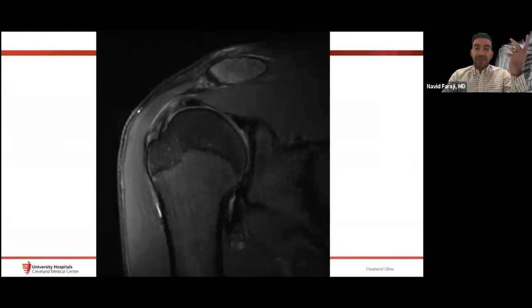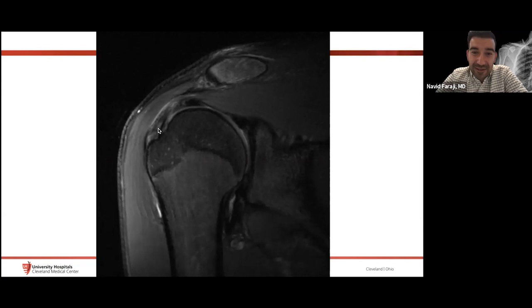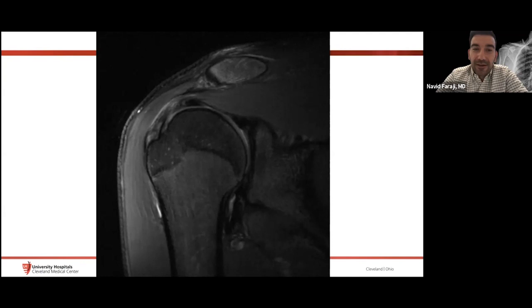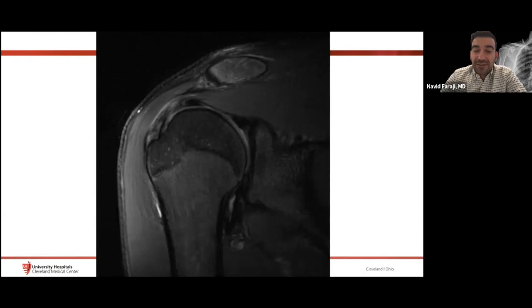Here's a bread-and-butter case. We see a fluid-sensitive fat-saturated sequence with an ugly-looking cuff tendon — this is the supraspinatus. It's thick with increased signal intensity compared to the homogeneously low signal normal tendon we saw previously. This is tendinosis. We can rate it mild, moderate, or severe based on thickness and signal. The key is there is no fluid signal intensity within this tendon to suggest a tear.